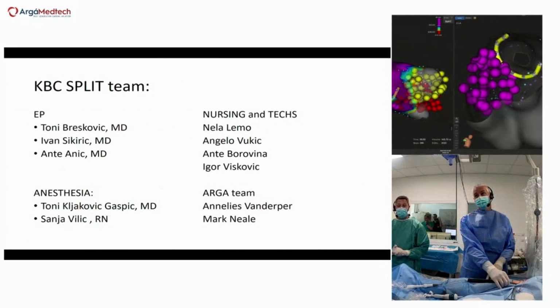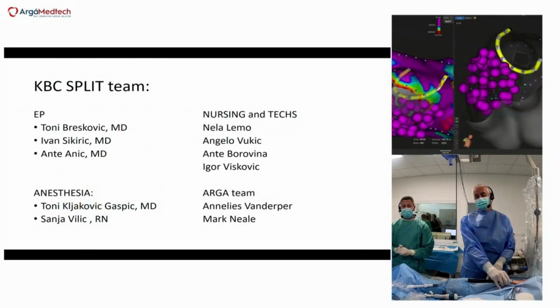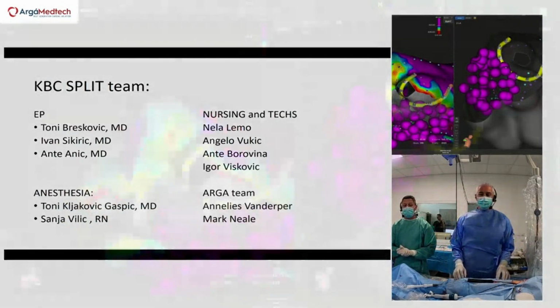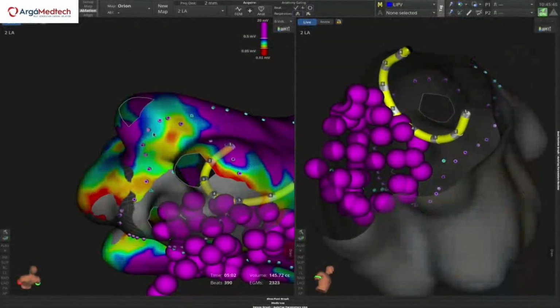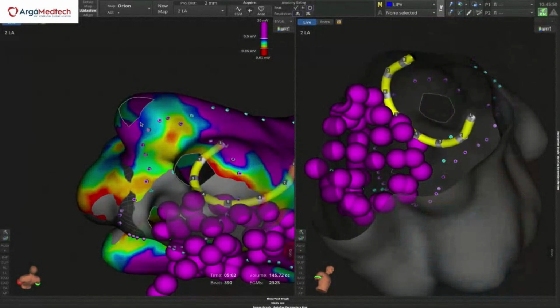Can we see a bigger screen with these maps? Because we see now just your team. Can you go to single view map? Single view, Ante, can you go to single view? Okay, just a single view to show what we have done. Single view on a 3D system, please. Good. So yes, I put it, but you don't see that. Hopefully you see it.